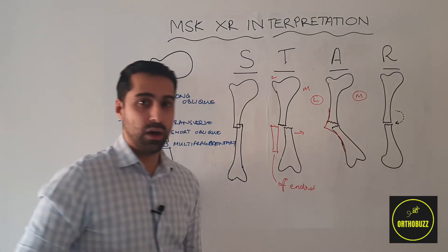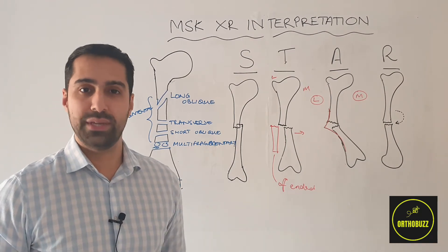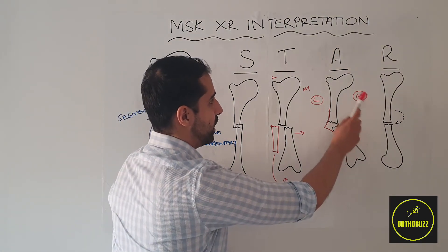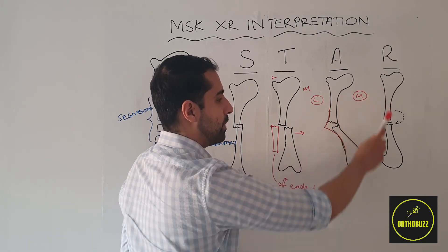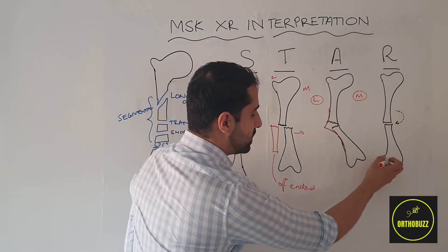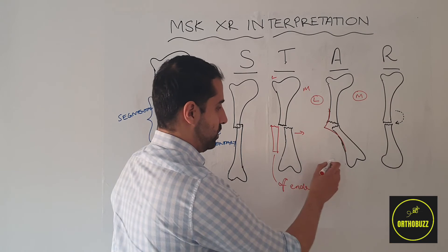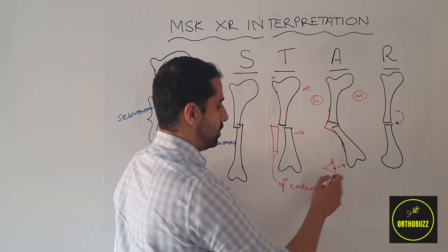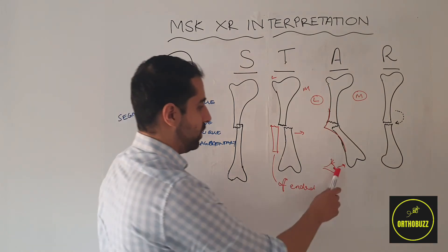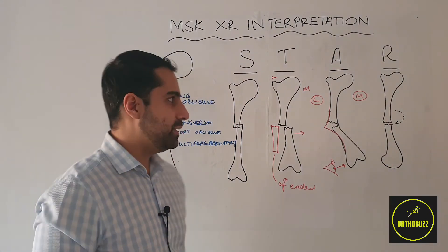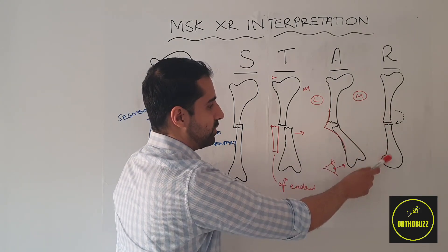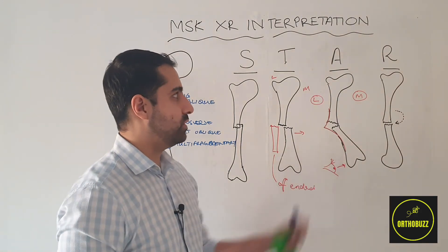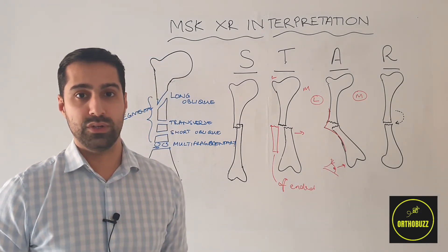Finally, R is for rotation. This is difficult to assess on 2D imaging and sometimes can't be commented on. In this case, we can see the proximal fractured end appears as an AP image, while the distal fractured end — the femoral condyle — appears as a lateral image. For us to be seeing an AP and a lateral image of the same bone, the distal end must have rotated. This would be described as a rotated fracture, though it can sometimes be difficult to comment on.